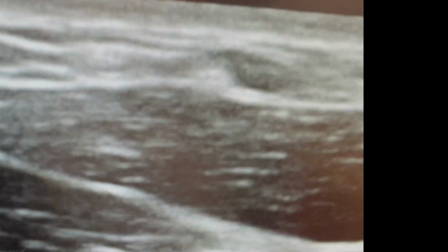But here's what a normal ultrasound would look like. And notice that when I rotate, I can see the vessel in a different plane as well. And this will come in handy when we do an ultrasound guided IV tutorial. But it's important to rotate your probe so you can get a 360 view of the structure that you're about to encounter, and you can see the full depth of what you're getting into.